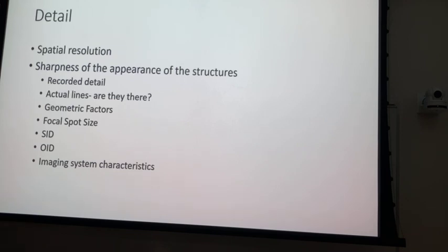Now, your monitor in the Lightroom, or whatever you're calling it now, it used to be the Lightroom because it's where we put the lights to hang the x-rays.